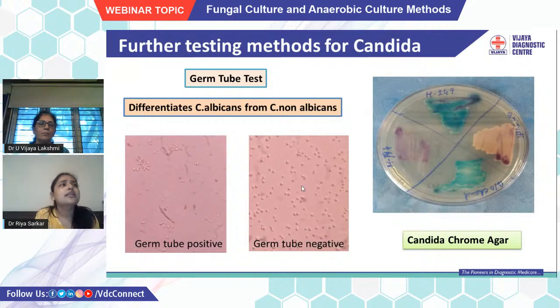Now, why is there a need to know whether it's albicans or non-albicans? It is because we have seen that Candida non-albicans is much more drug resistant than Candida albicans. Hence, with this small test, you get a basic idea of what antifungals you are supposed to use in your patient and how challenging the treatment might be.